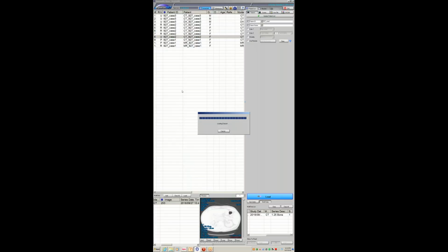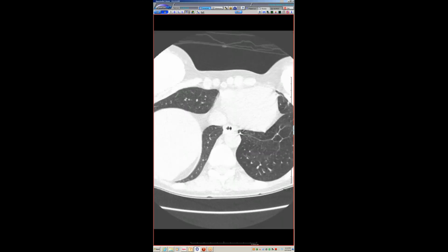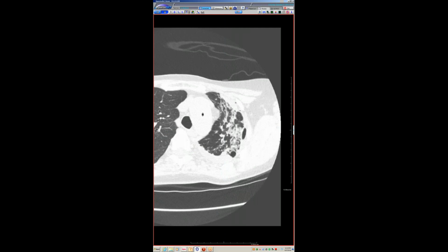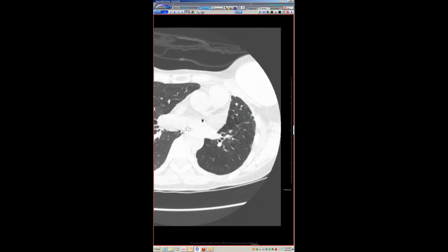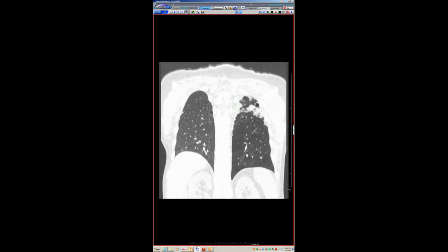Clear findings of obliterative bronchiolitis based on expiratory imaging, which I did not include, in the left upper lobe. And here you can see the right transplant lung, which is retransplant, looks really good, but she has this progressive scarring. She's got a little loculated hydropneumothorax, and she's got obliterative bronchiolitis in the left lower lobe.